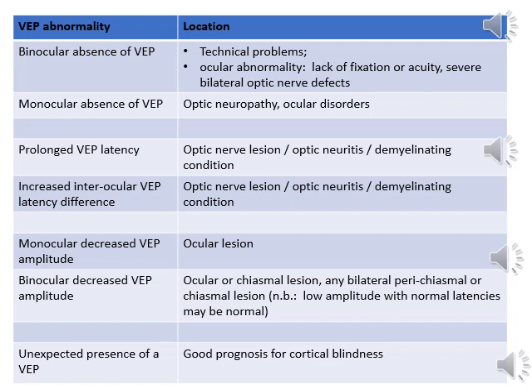As previously discussed, amplitude is not a criteria that we typically use to call the VEP abnormal. However, if there's an asymmetry between the two eyes, then one could consider an ocular lesion, particularly a compressive lesion in the eye that has the lower amplitude. If the amplitude of both eyes is very low, then one could consider an ocular lesion or a lesion in or around the chiasma. But it must be noted that low amplitudes with well-formed waveforms and normal latencies might be normal.